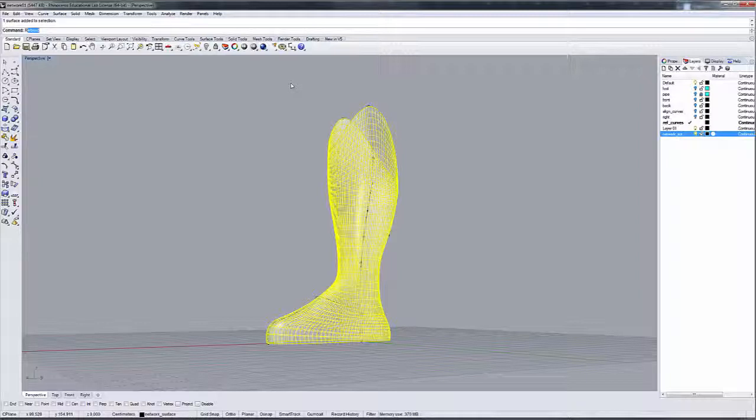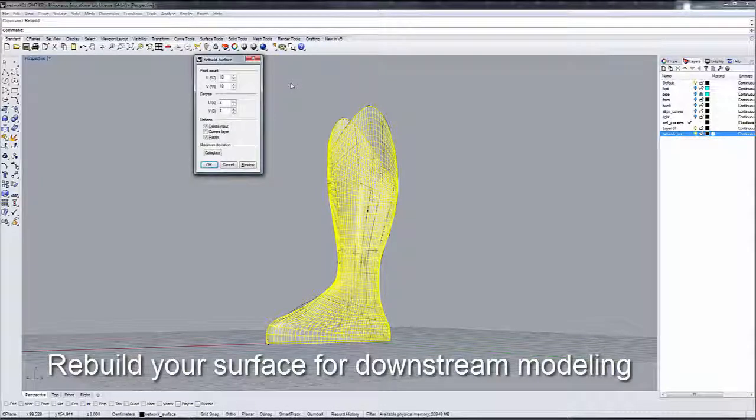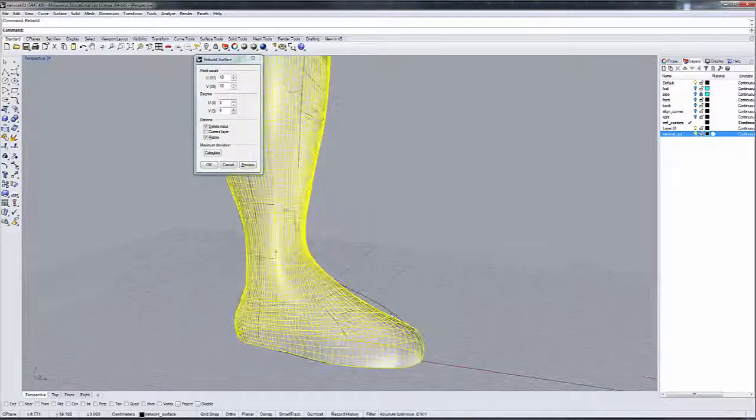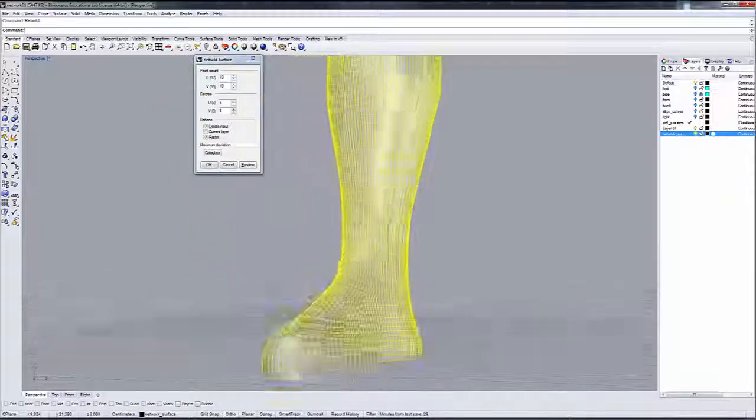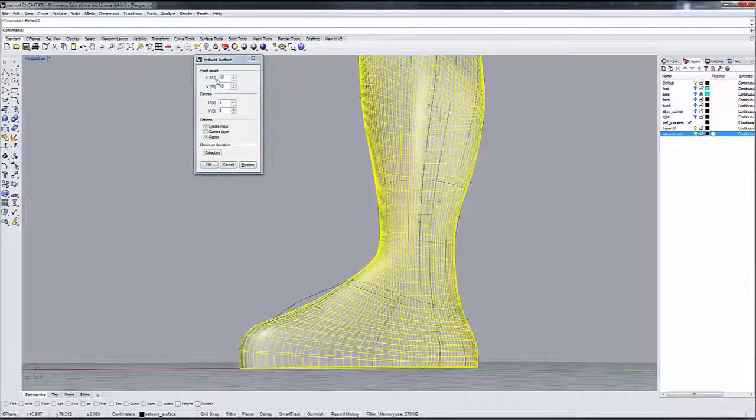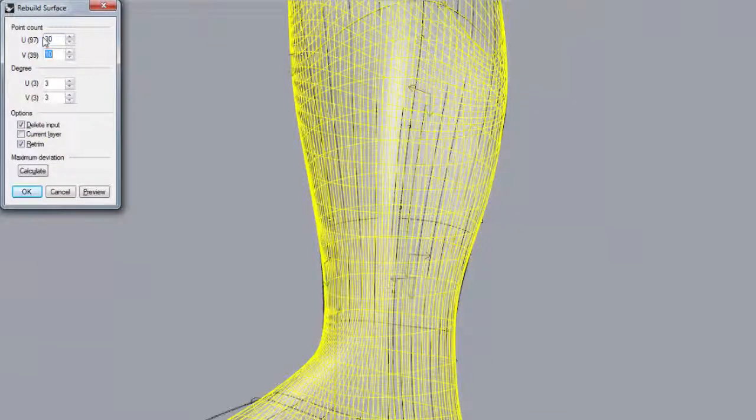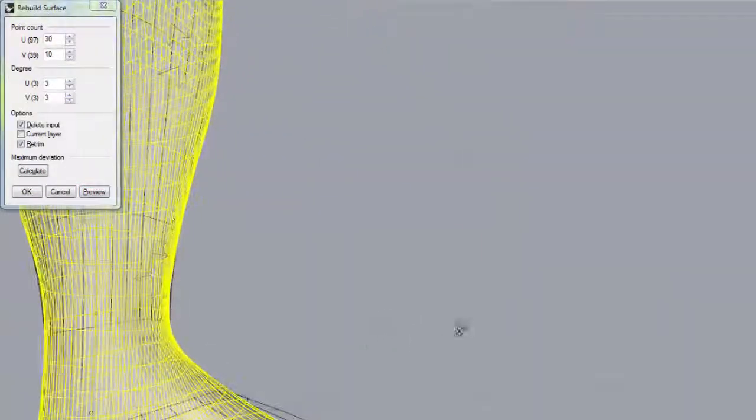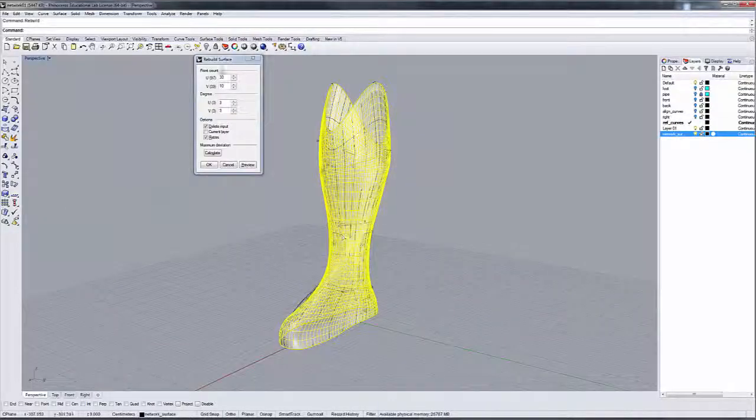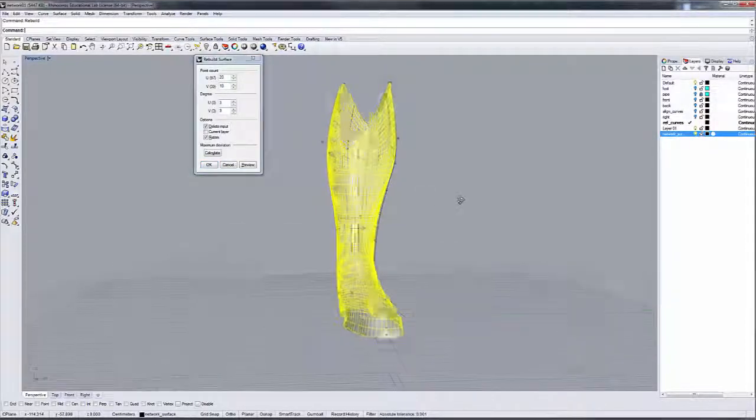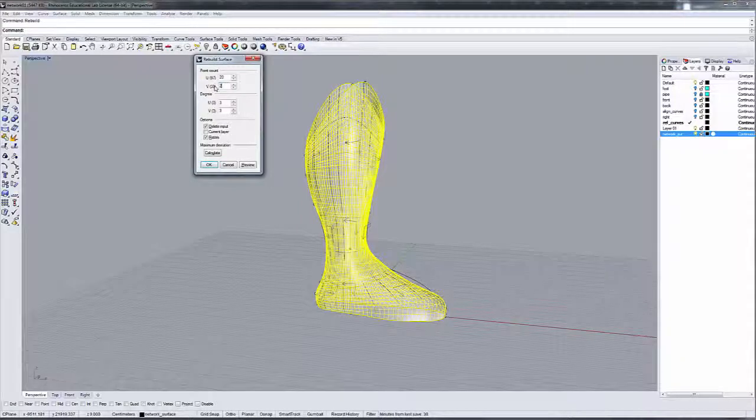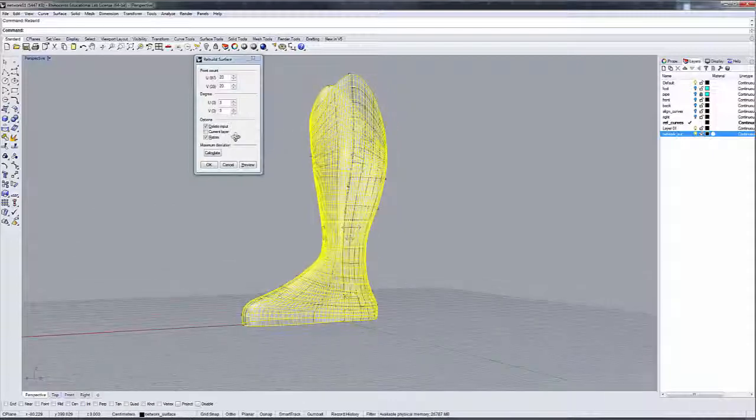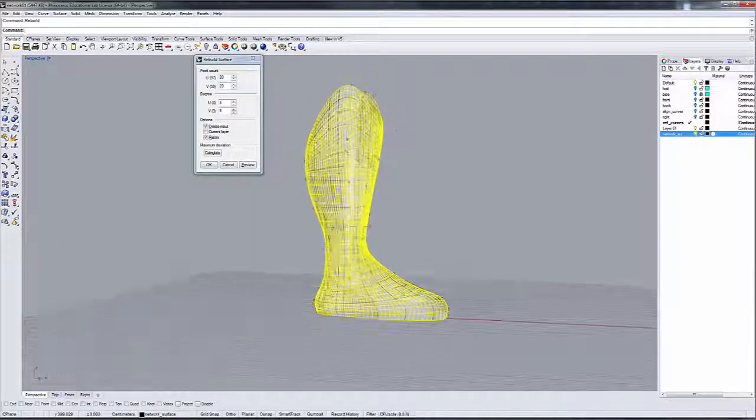One of the things that I want to do at this point is that if I were to look at the surface and I did a rebuild, it's a very complex network surface. And I want to simplify it a little bit. There's 97 in U and 39 in V. I'm going to cut this down to 30. Let's go 20. 20 and 20. And we're basically reparametrizing the surface and making it a lot simpler.